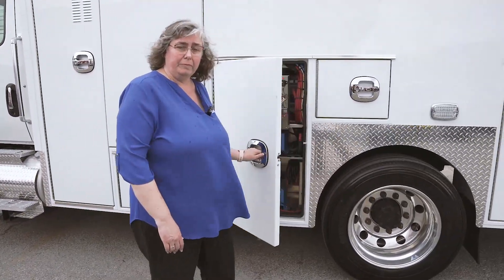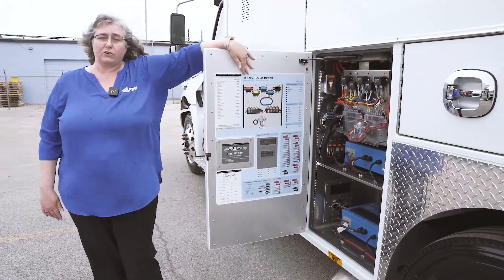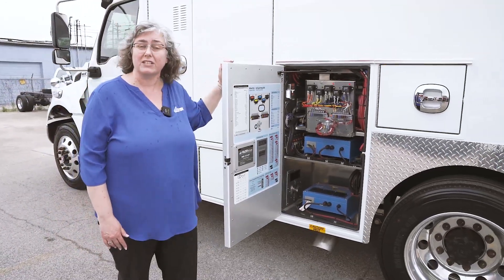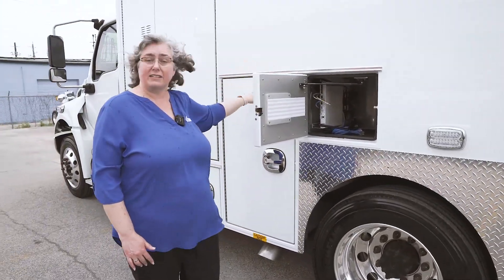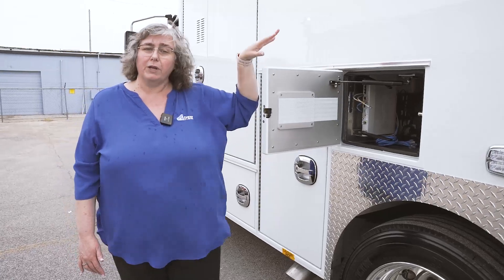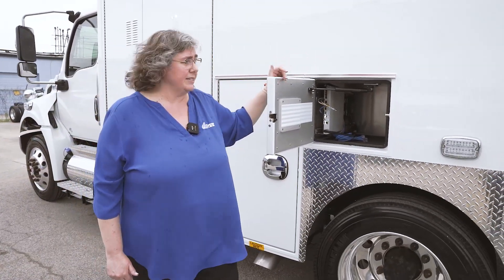Our electrical compartment is here. As usual, we have our Frazer electrical print to tell you how to get a hold of us and also to help you with any fuses or easy, simple fixes. We have another compartment that's tied into the electrical compartment and kept climate-controlled so that we can put routers and other sensitive Wi-Fi equipment inside.